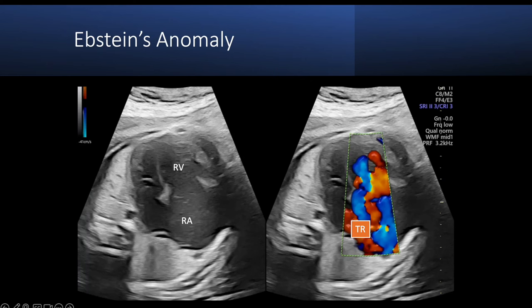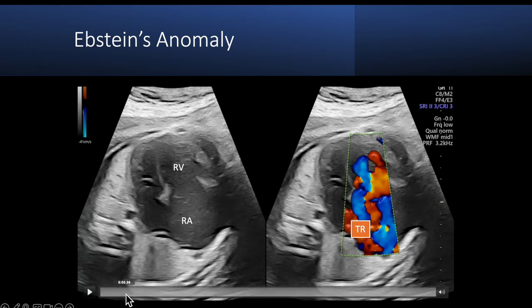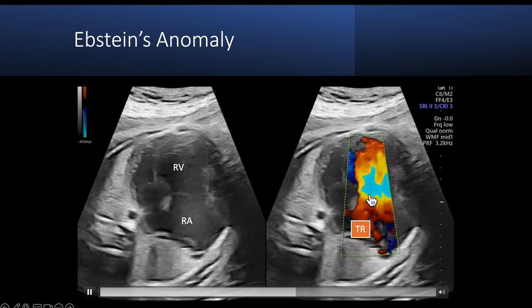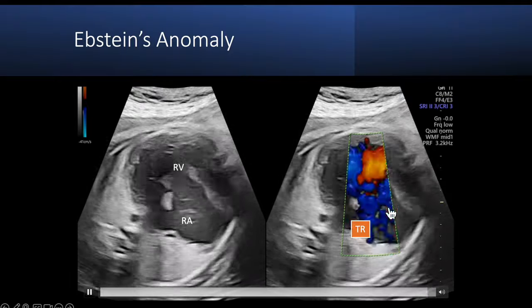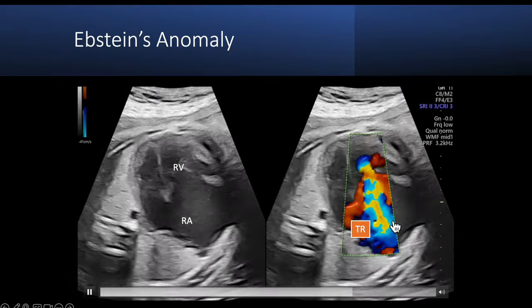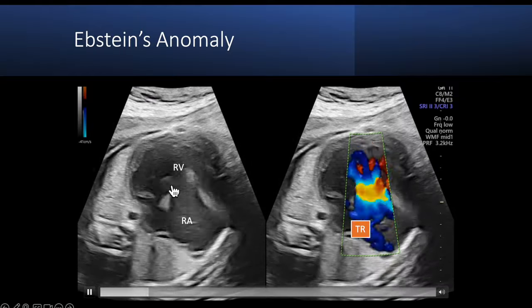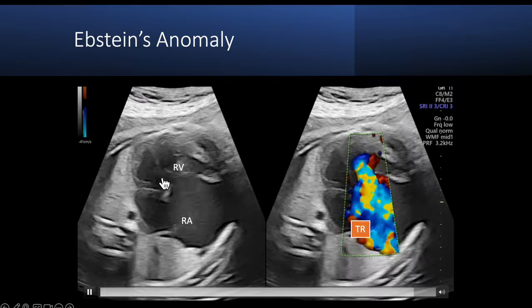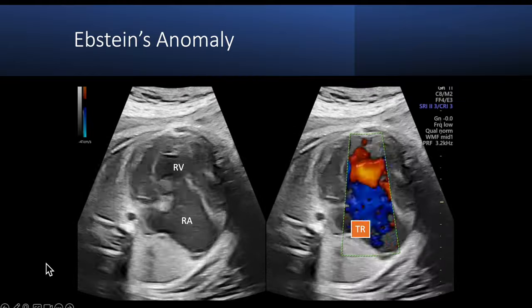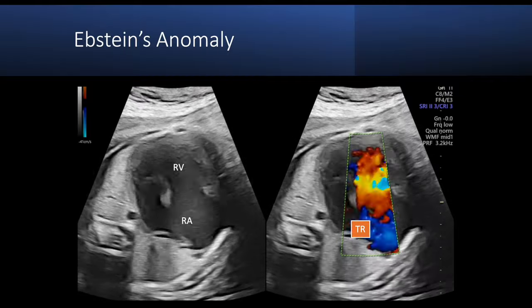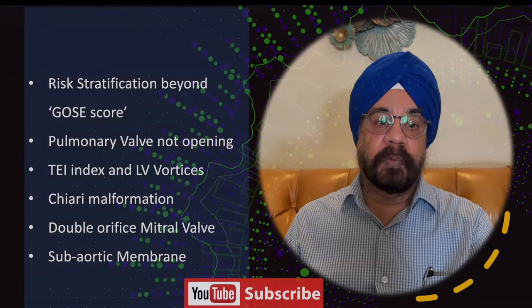This is an Ebstein anomaly case during prenatal screening. You can notice there is large, severe tricuspid regurgitation filling the entire right atrium. The reason for the tricuspid regurgitation is the septal leaflet, which is tethered to the interventricular septum — a hallmark of Ebstein's anomaly.